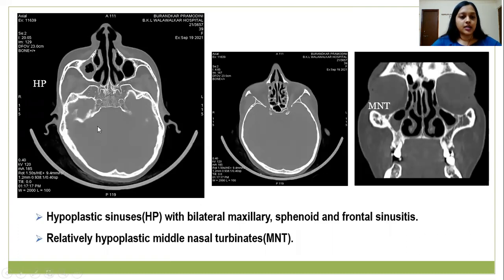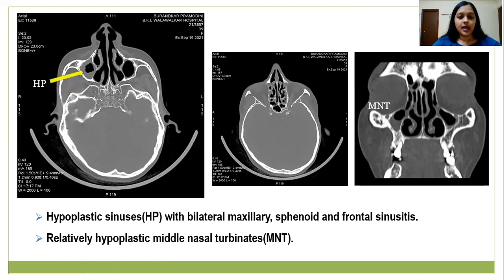CT of the paranasal sinuses revealed hypoplastic sinuses and bilateral maxillary, sphenoid, and frontal sinusitis. A relatively hypoplastic middle nasal turbinate is seen here.